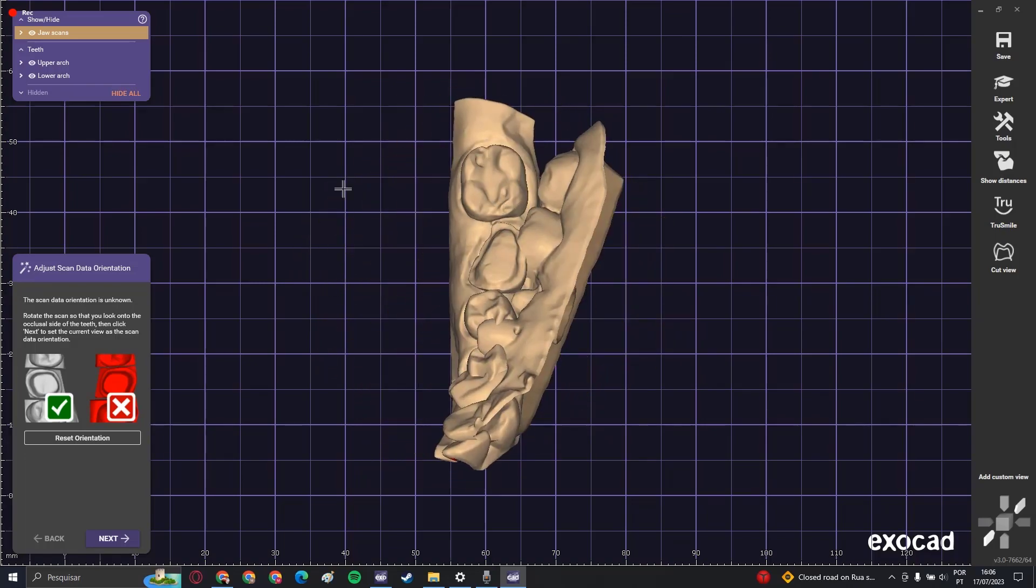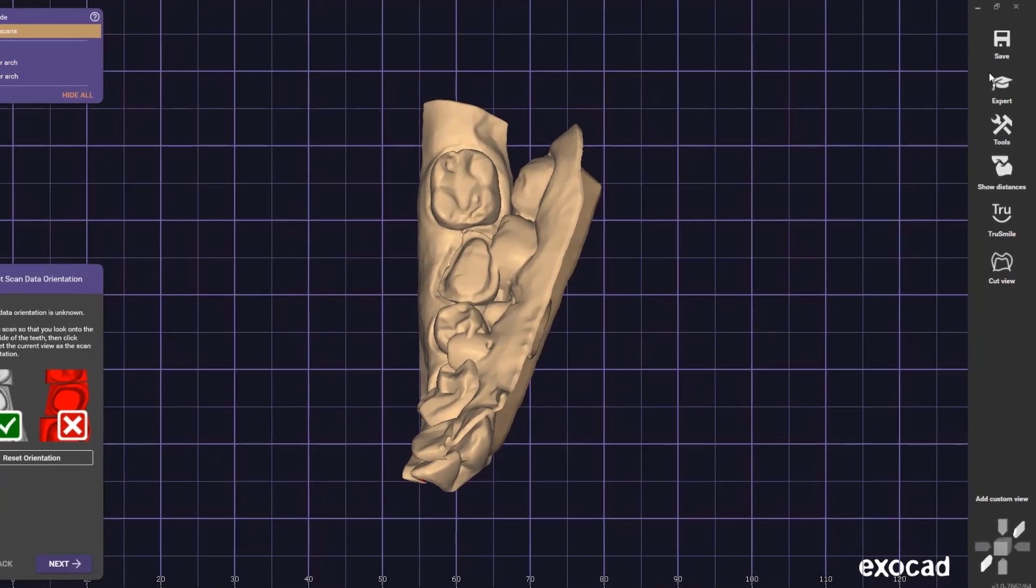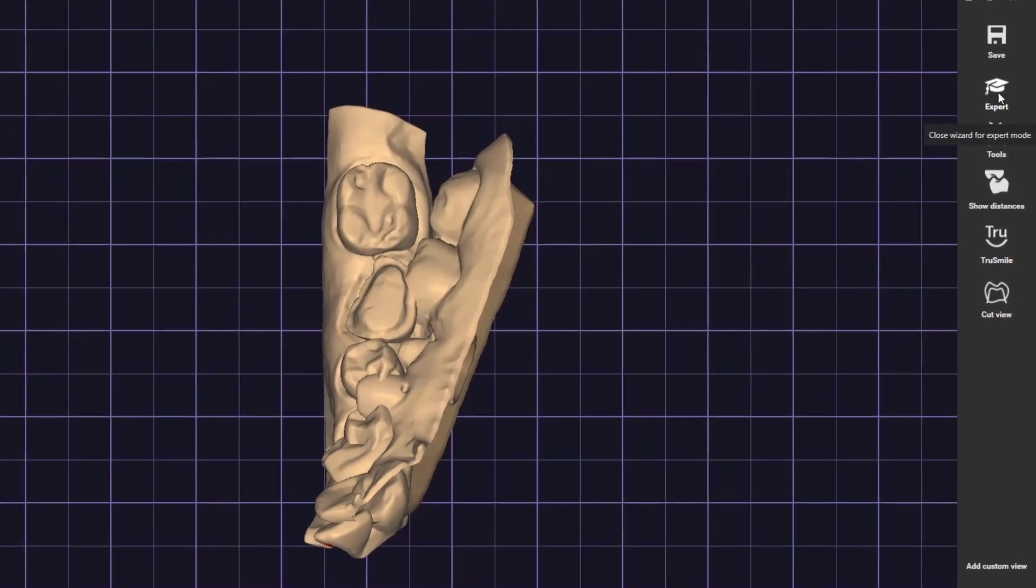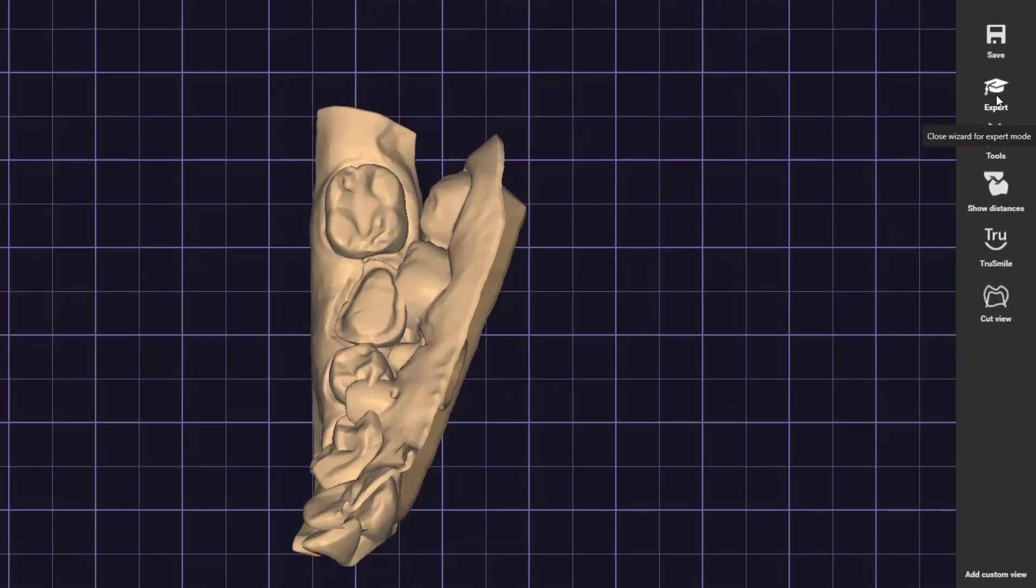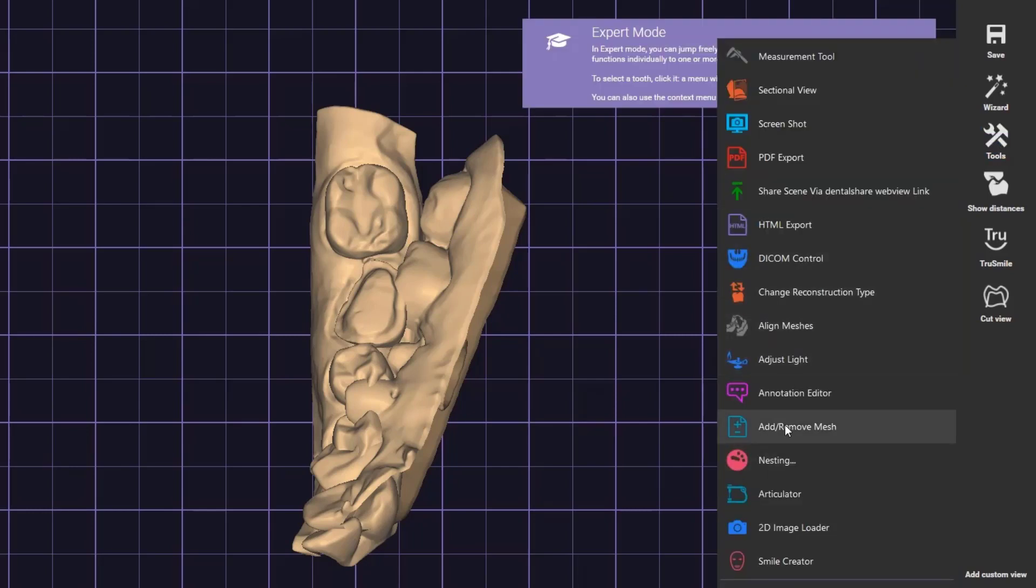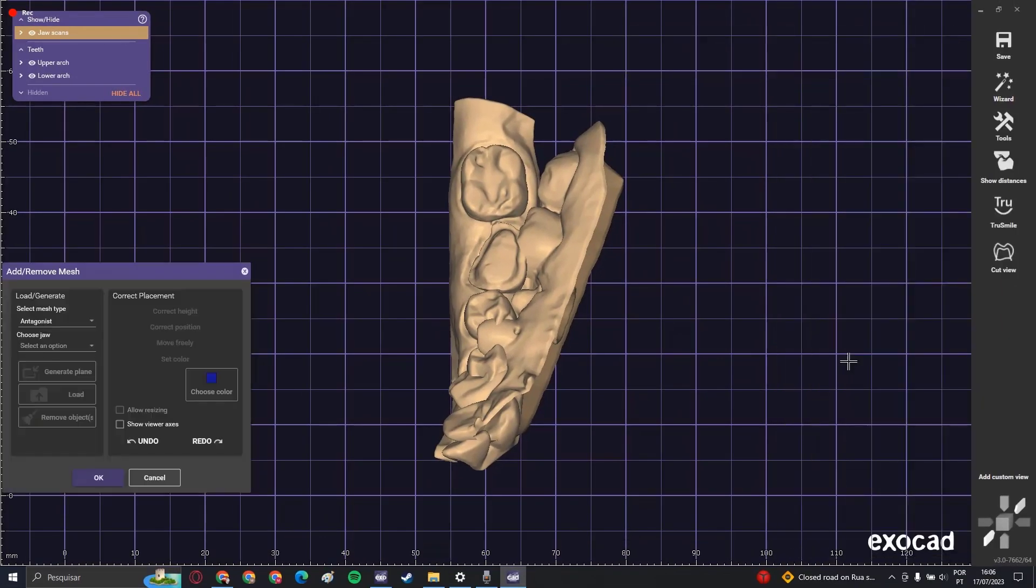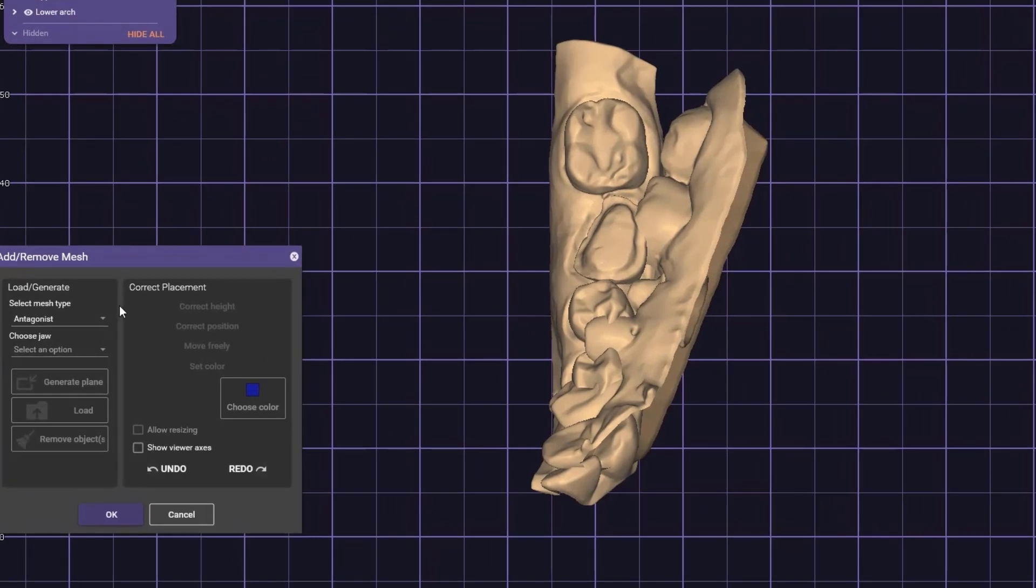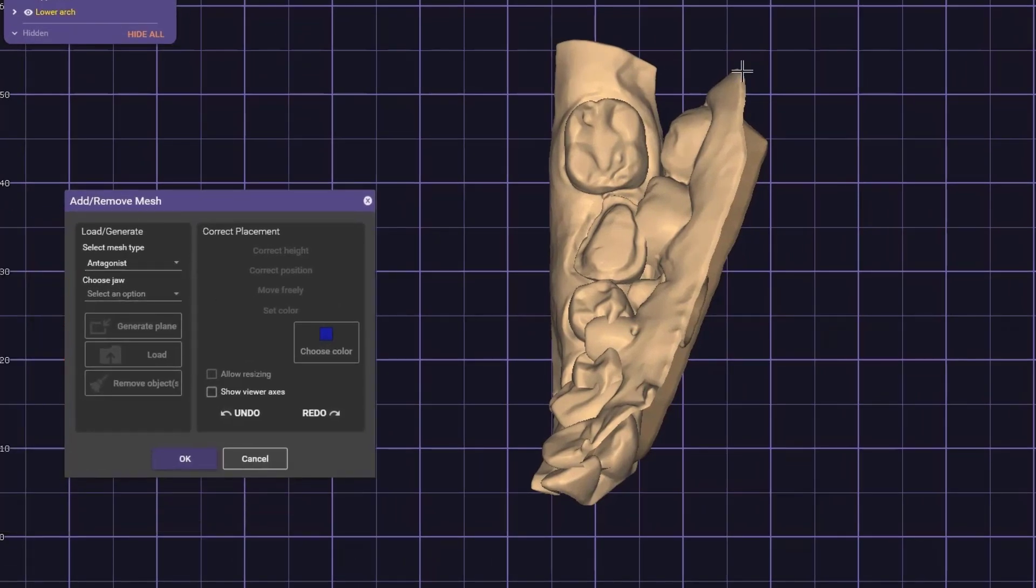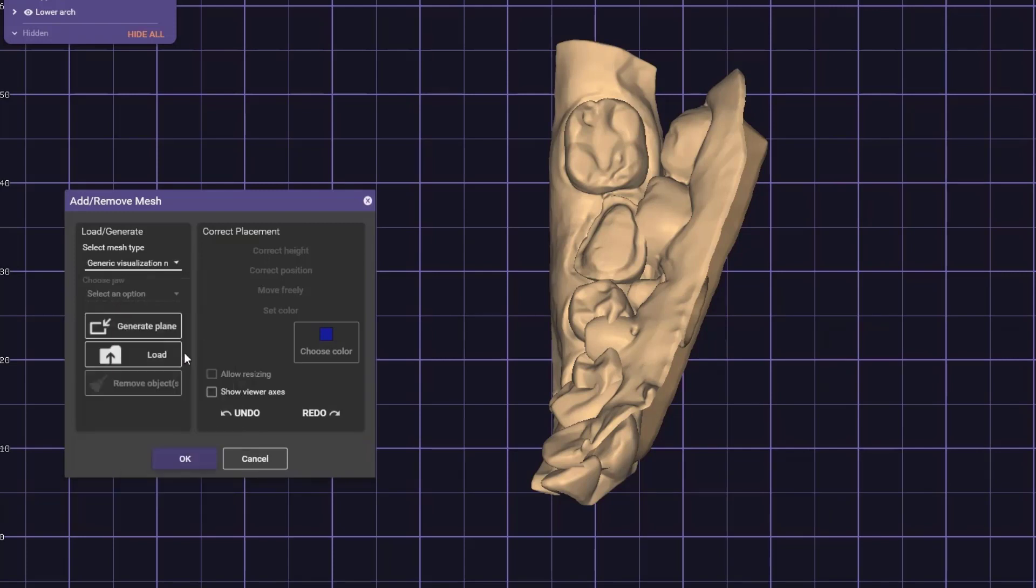To put them in the right occlusion, click on expert mode, then go to tools and select this tool, add and remove mesh. Now we want to open up the bite scan mesh. Select mesh type and go to generic visualization mesh.